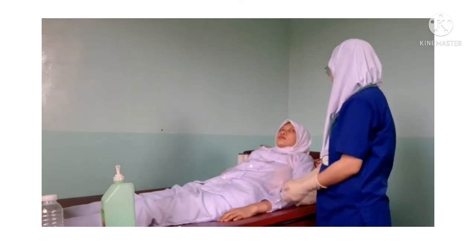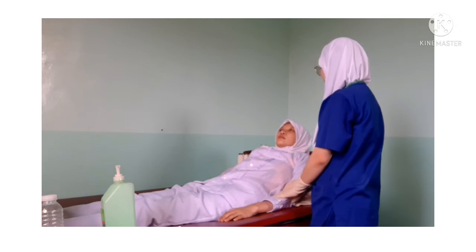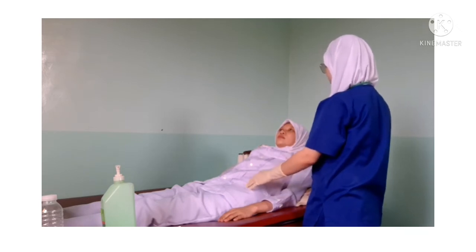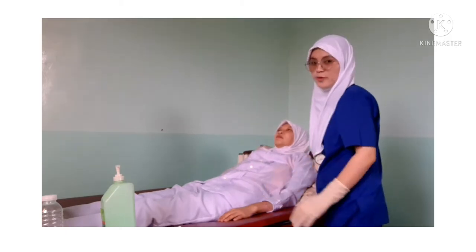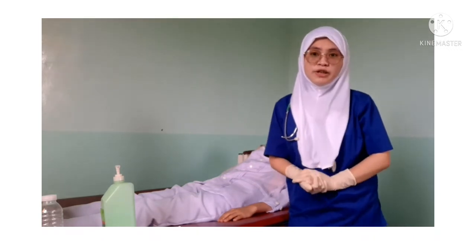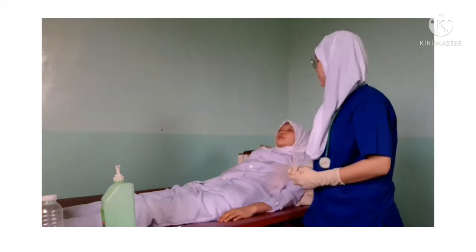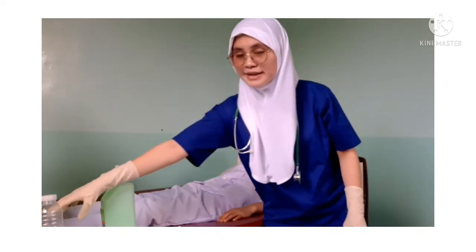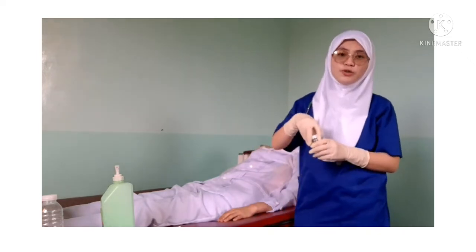So, ma'am, breathe in using your abdomen 3 times and directed cough. Okay. And cough. Okay. If the patient did not produce any sputum, repeat abdominal breathing and directed coughing. So, since the patient already produced a sputum, we're going to collect it.